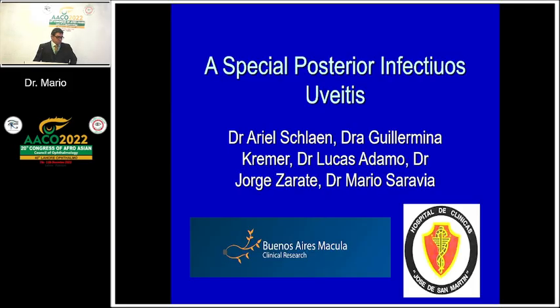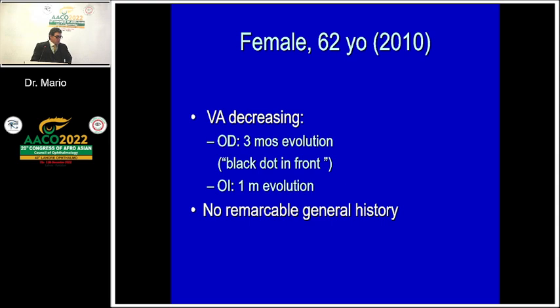This is a case after this magnificent lecture about vasculitis. You are going to make the diagnosis very easy. Well, next, what is this one? This was a female of 62 years old. This case was more than 10 years ago.